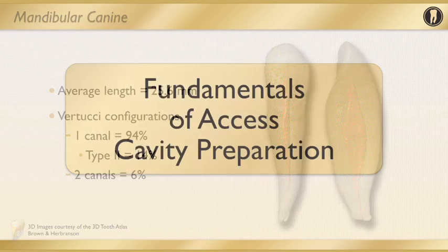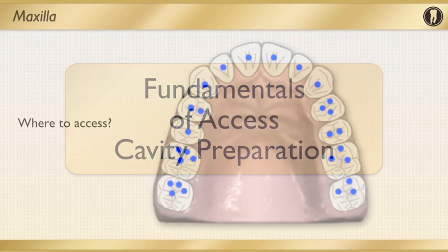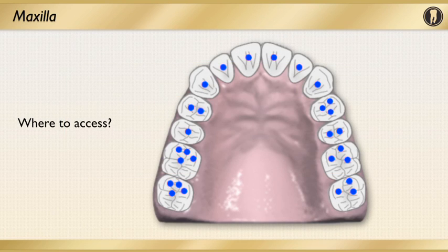Now let's discuss some of the fundamentals of access cavity preparation. Here is a diagram. It just shows a general idea of where you want to start your access. Looking at the maxillary anteriors, I start a little bit lingual on these compared to where the blue dot is.